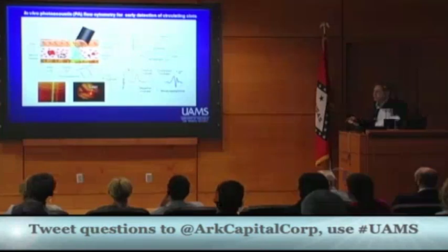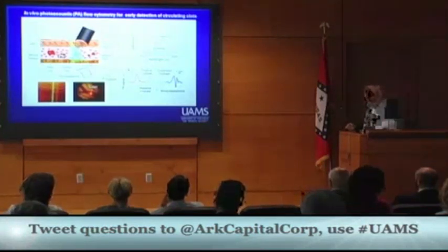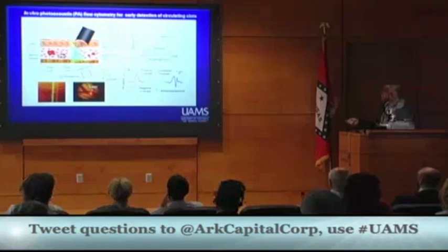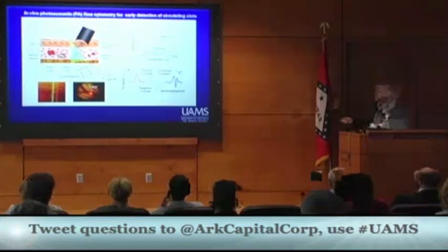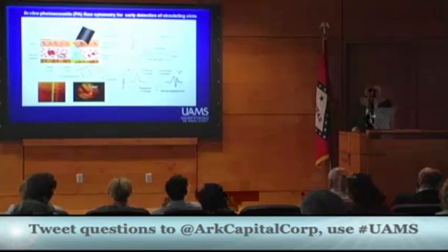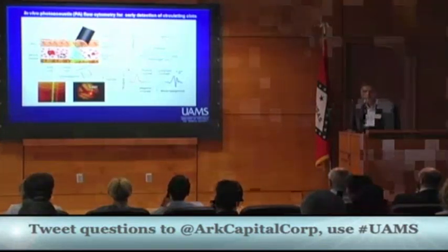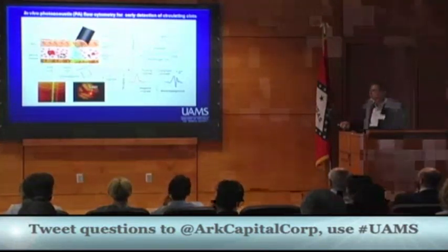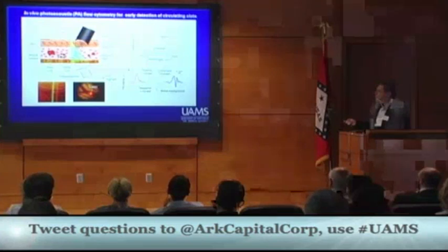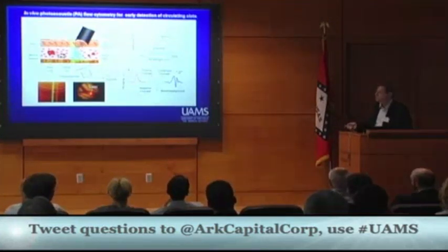That's why it's very simple, it's portable, just a laser, irradiate vessels, you produce acoustic signals. We can monitor blood continuously. What we found, usually if cancer cells, bacteria, virus, they produce, we call it positive signals, signals above some background. But occasionally during monitoring for few years, what we found? We found some negative signals. We thought it's artifacts, it's noise, it's not related.